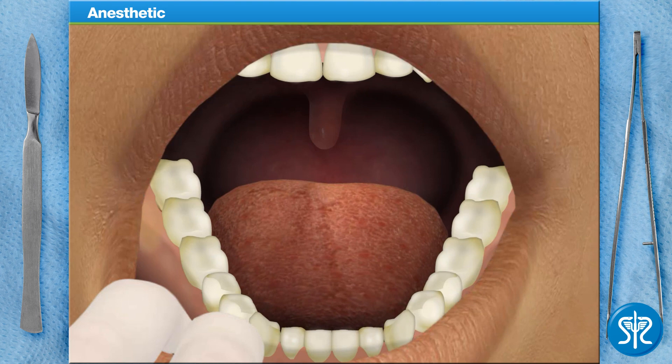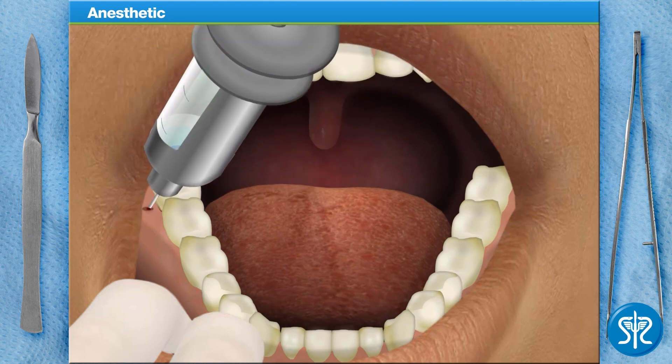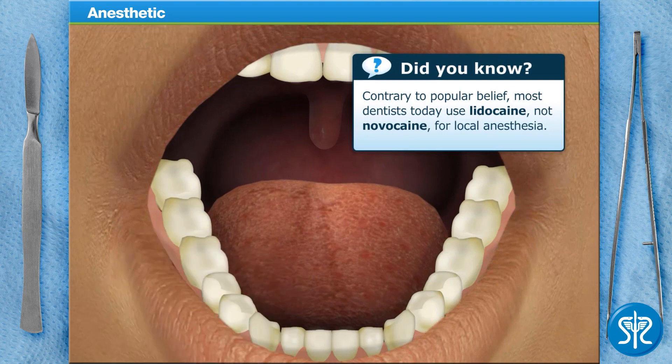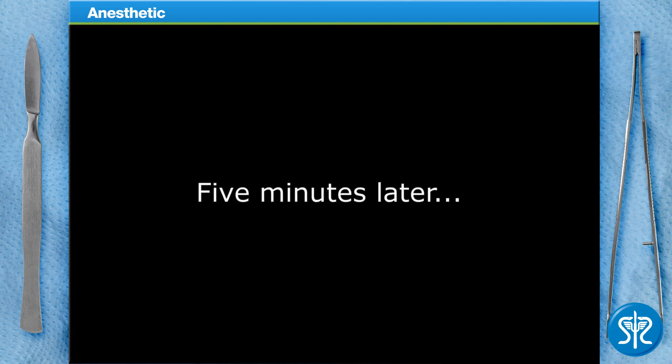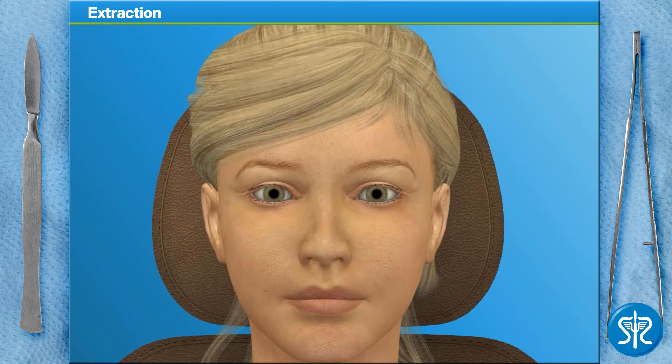Next, we can inject the local anesthetic. The patient may feel a slight pinch as the needle is inserted. After that, the area will become numb for a few hours. And now we'll give our patient a few minutes to become completely numb. The patient's mouth is numb, and now we can move on to removing the wisdom tooth.